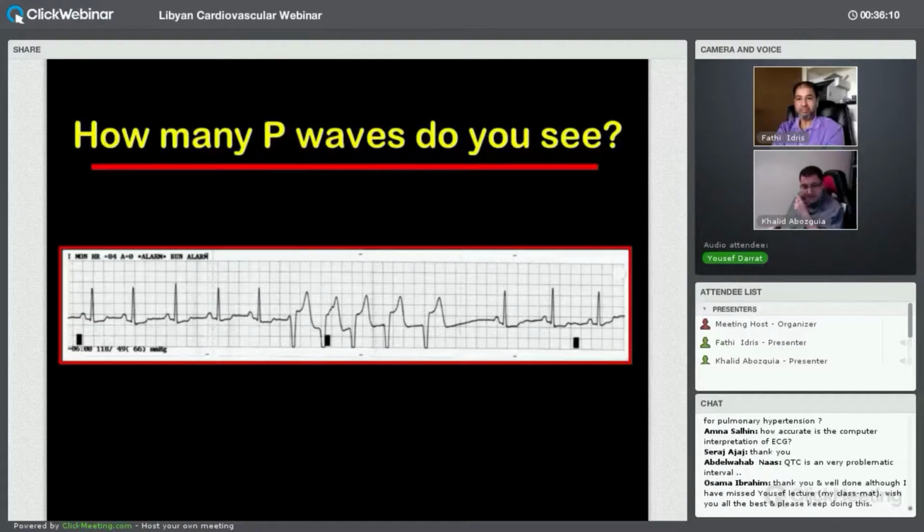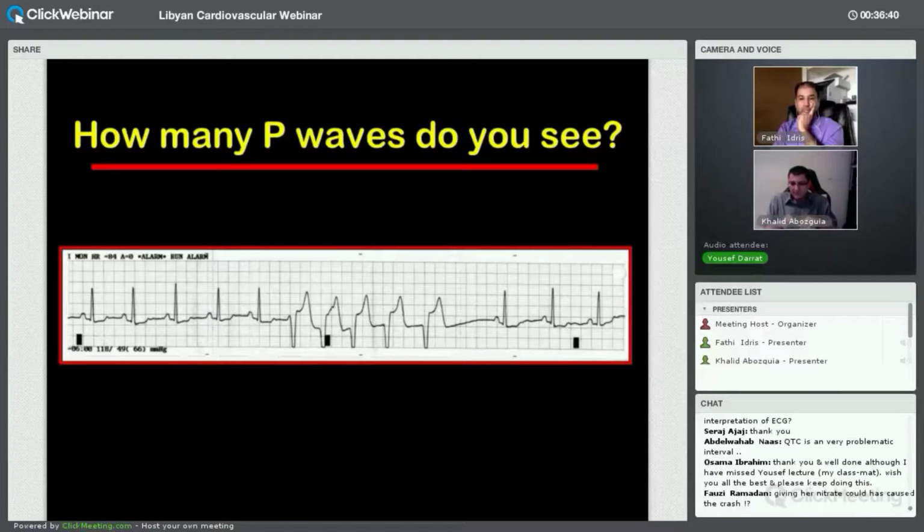I don't think it's very accurate, depending on, like you said, the different computer algorithms. But I did mention to you before that I did a really small pilot study when I was a resident, and I tested the effects of the computer generated report, and even cardiology fellows were affected. If it was a false interpretation, they would go with the EKG interpretation. So a lot of people are biased by the report, even though it's wrong.